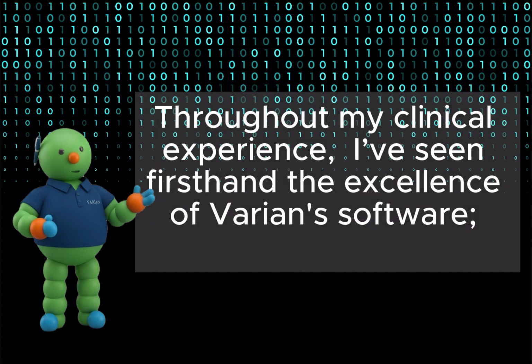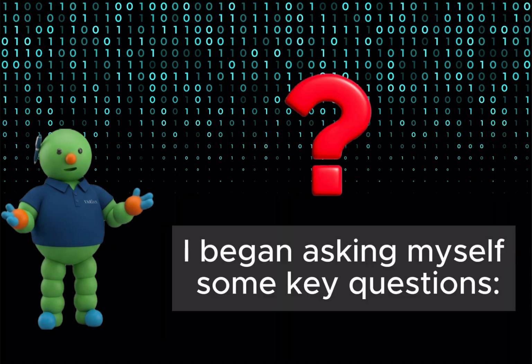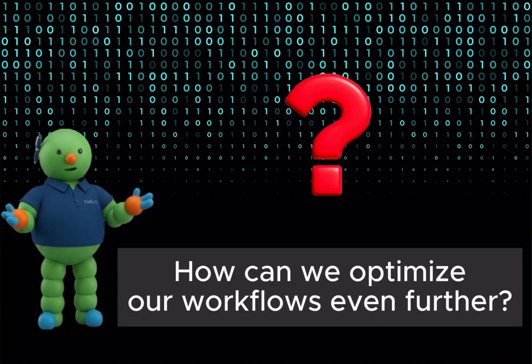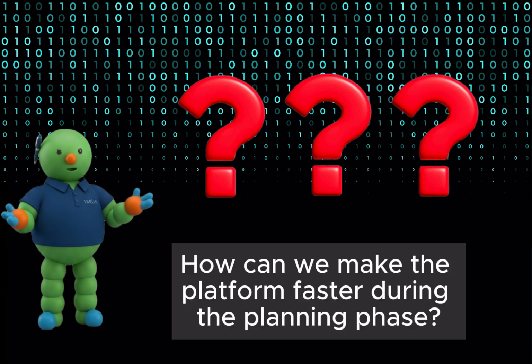Throughout my clinical experience, I've seen firsthand the excellence of Varian software. It's an incredibly robust system, however. As I started delving into its programming capabilities, I began asking myself some key questions. How can we optimize our workflows even further? How can we make the platform faster during the planning phase?